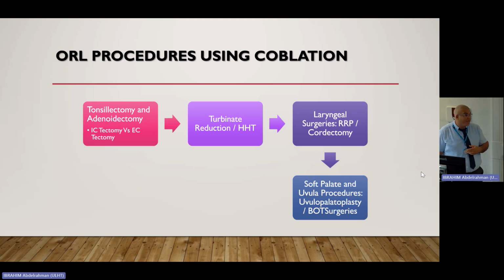I use it frequently when I get a supraglottic airway obstruction. It's really safe to use in tumors, with minimal invasion to the tissues and a lower rate of bleeding. If you use a laser, it causes thermal damage. If you use a microdebrider, you get easily swollen tissue post-operatively, which can end up in tracheostomy.